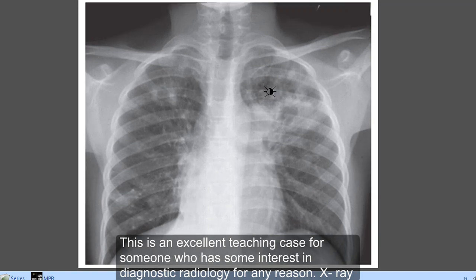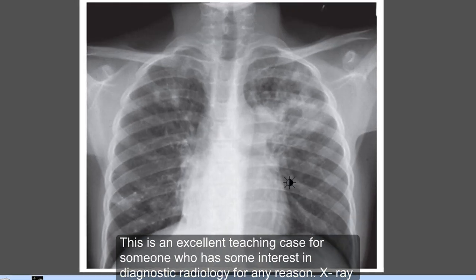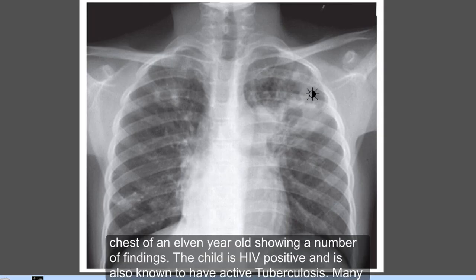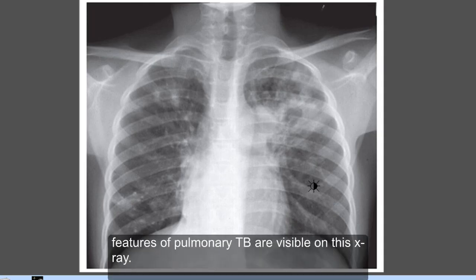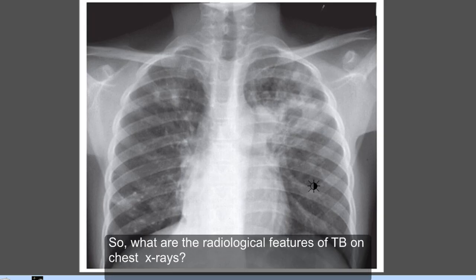This is an excellent teaching case for someone with interest in diagnostic radiology. This is a chest X-ray of an 11-year-old who is HIV positive and is also known to have active tuberculosis. Many features of pulmonary tuberculosis are visible on this X-ray.